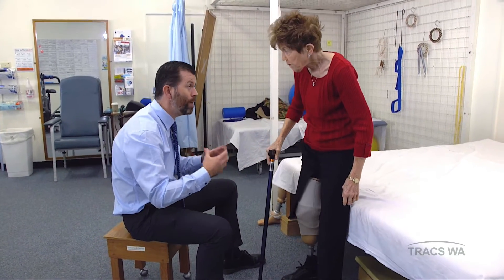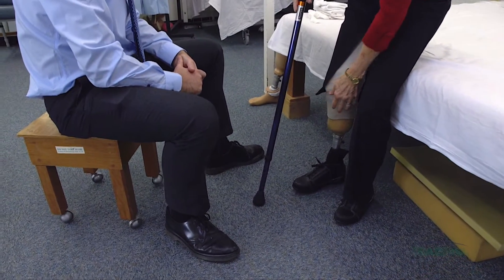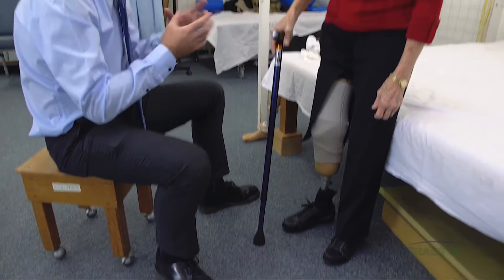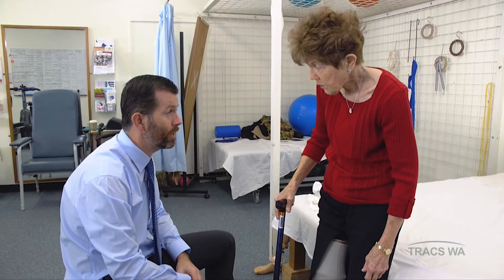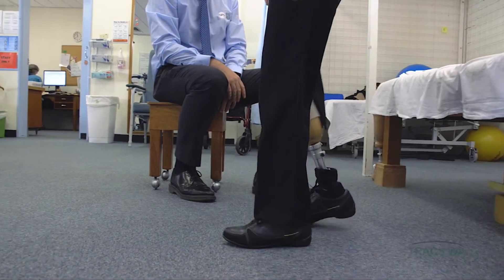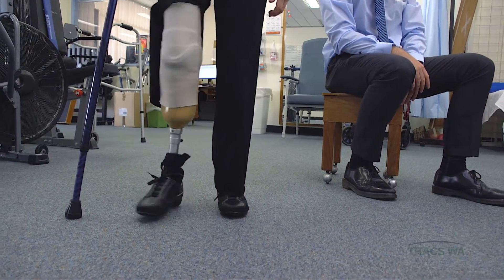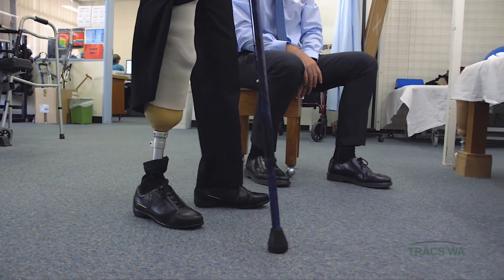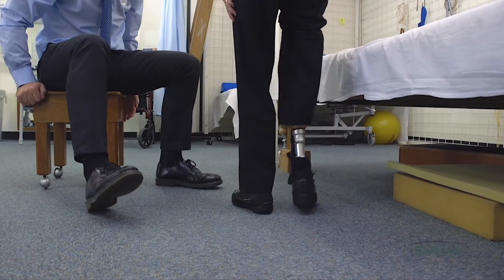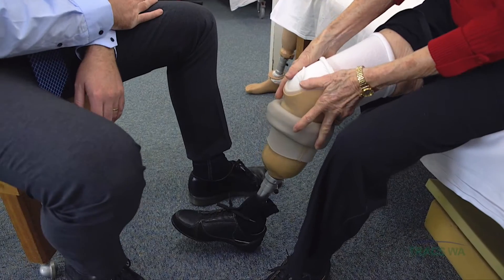That prosthesis should feel a little bit firmer and not quite so loose inside. It might feel like there's a little bit more cushioning from the socks, but it should feel nice and firm. Just take a couple of steps up for me, then turn around and head back. It does feel a bit different — a bit higher. It should feel a bit more secure and hopefully a little bit more comfortable.